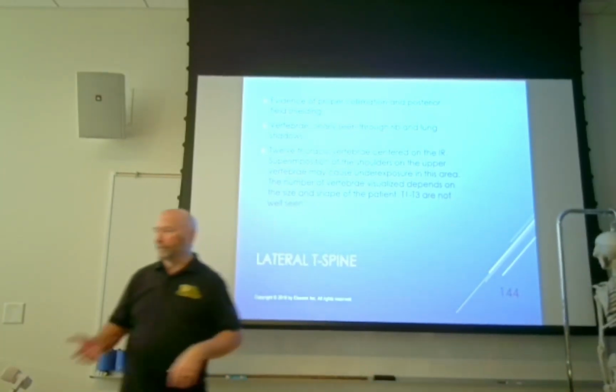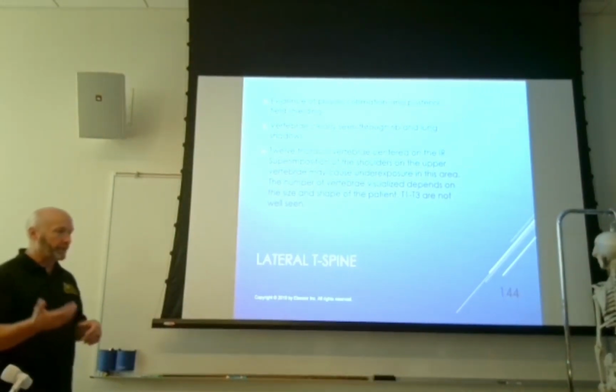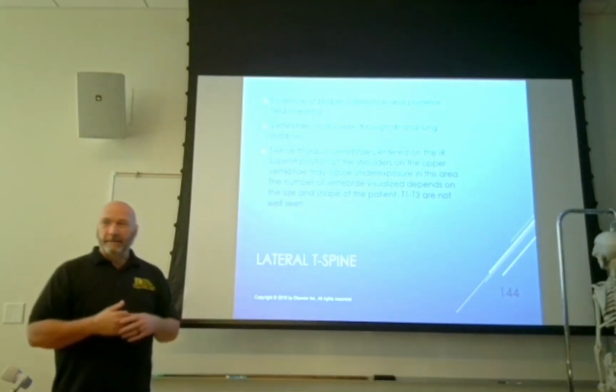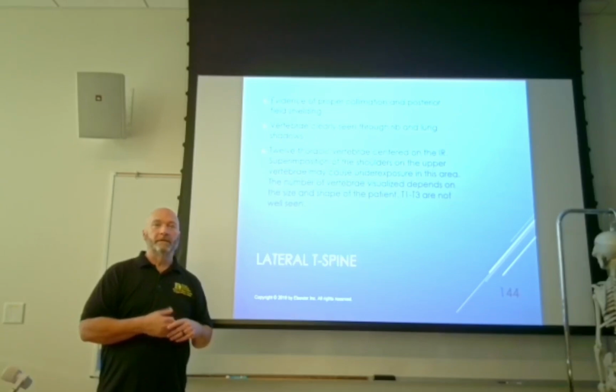So if you're setting a technique, what you would want to do is use a principle we're going to talk about in physics called reciprocity. Anybody know what that means? Just a word, reciprocity. What is a reciprocal saw? Anybody ever worked with a reciprocal saw?